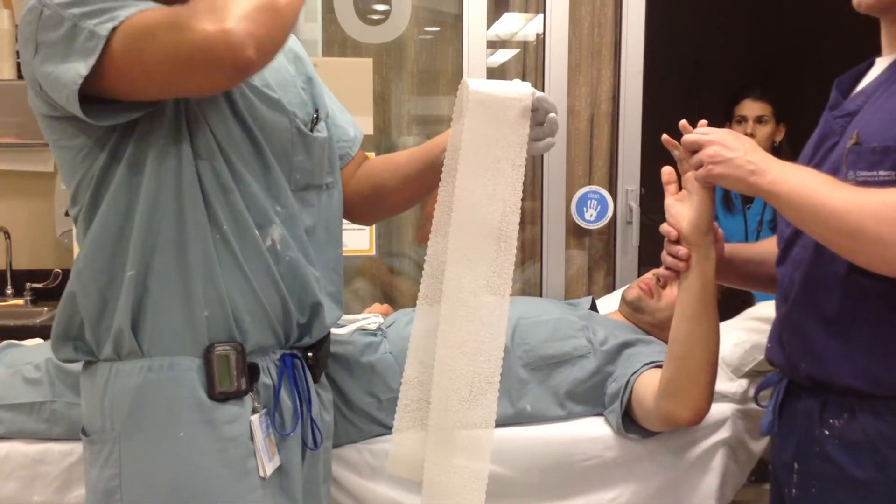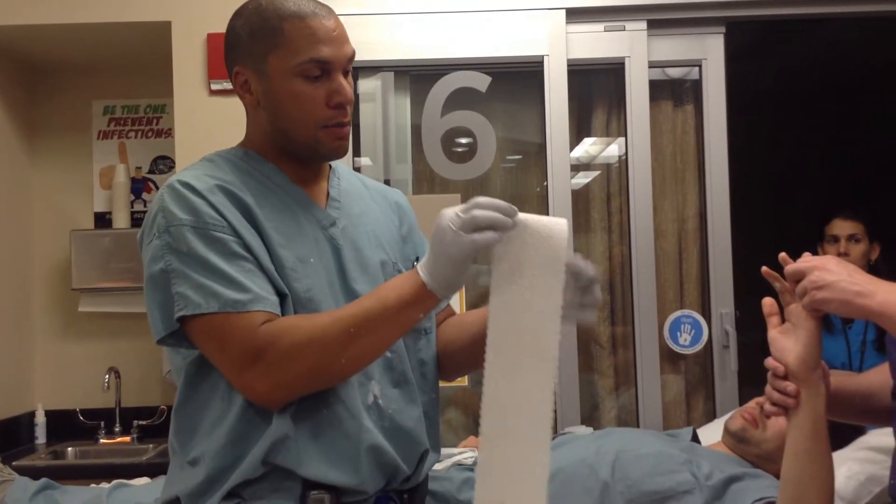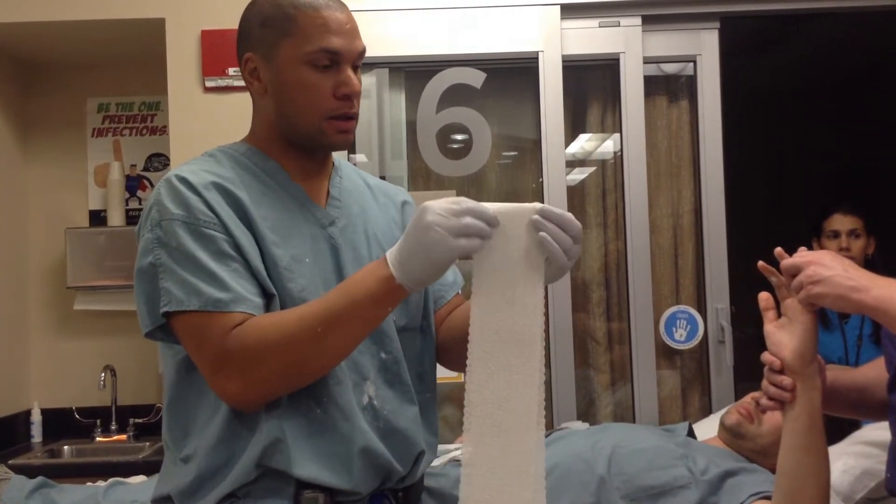I don't know if you saw it, but I measured that, and then kind of automatically when I went to make my lengths, I just made it a little bit longer. It was kind of just second nature.